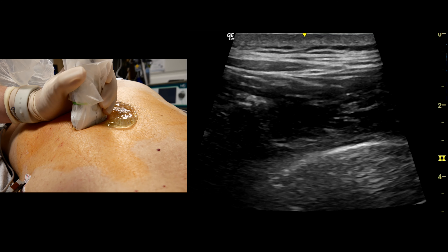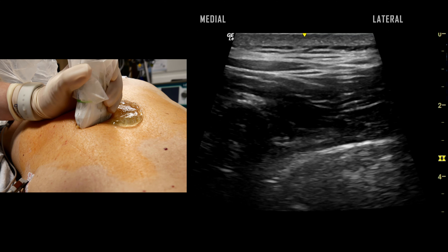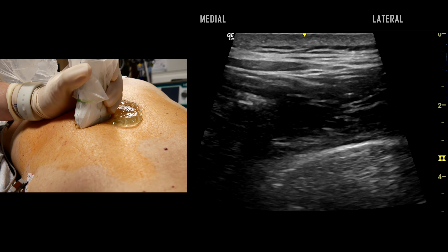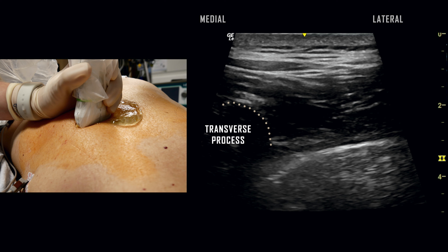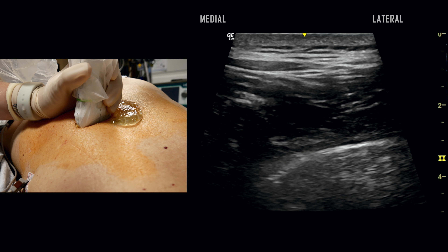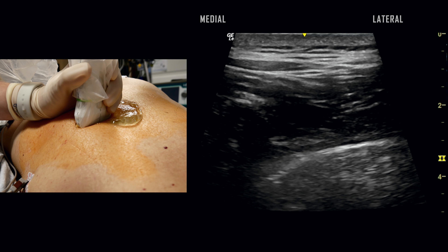The same patient is now undergoing a left-sided thoracic paravertebral block at the same level. The transverse process again is seen in the lower left corner of the image, and the adjacent bright hyperechoic line represents the parietal pleura. The superior costotransverse ligament and internal intercostal membrane are not visualized as clearly here. The muscular structures are again identified.